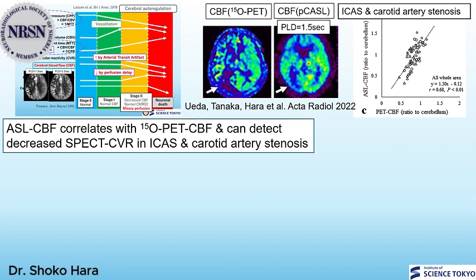We have found that in patients with ICAS and carotid artery stenosis, CBF values obtained with ASL correlate well with true CBF measured by 15O PET. The underestimation of CBF caused by perfusion delay was offset by the overestimation from arterial transit artifacts, resulting in a moderate correlation.